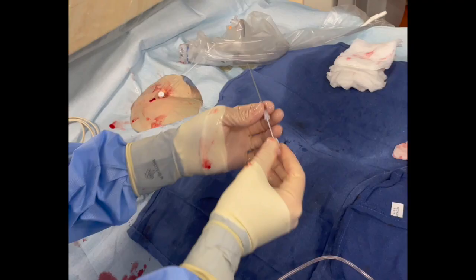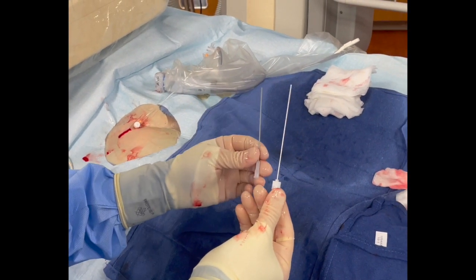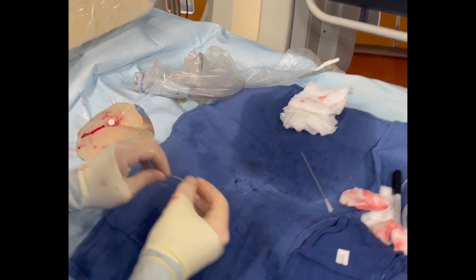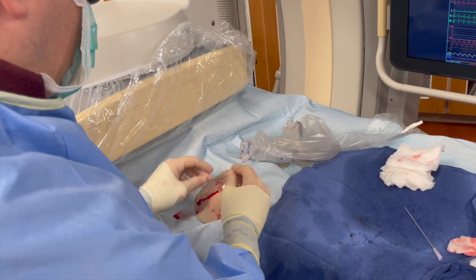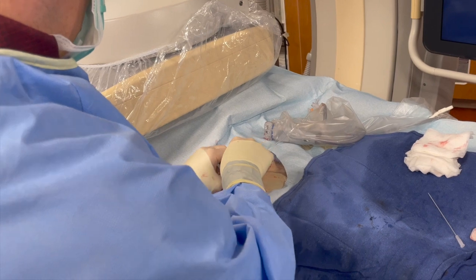I use the inner dilator of the microsheath to perform femoral angiography, especially if I'm going to plan to use large bore access and heparinize to therapeutic levels.